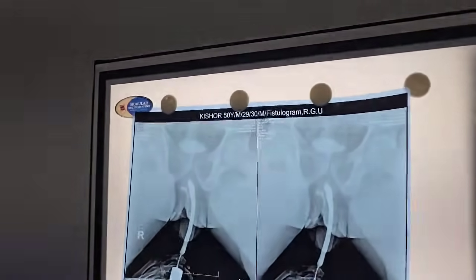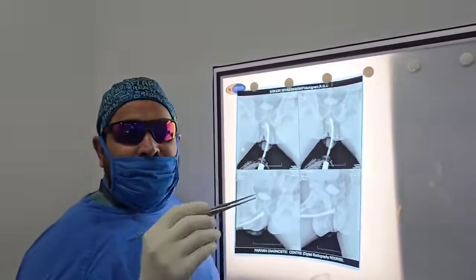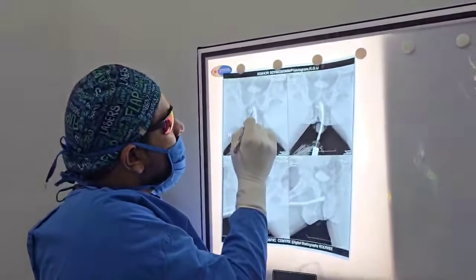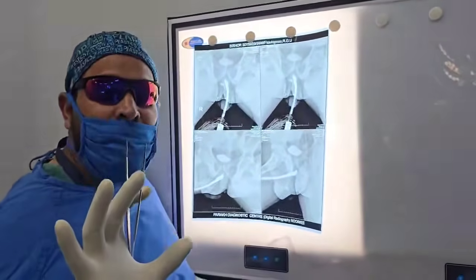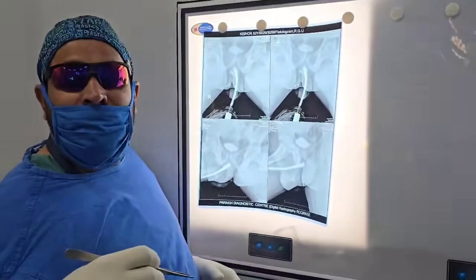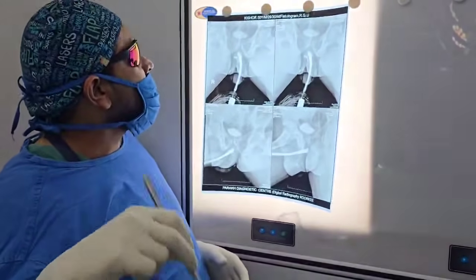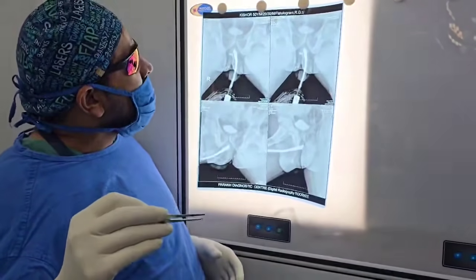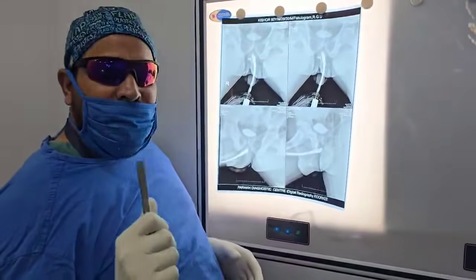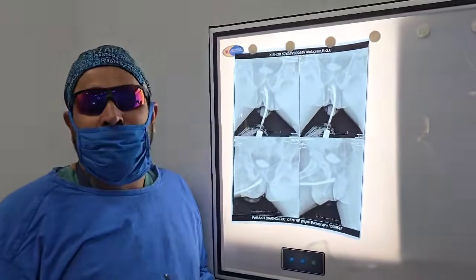What happens when we give laser ablation? When we give the laser energy nearby this area, sometimes there may be friability of the tissues, which are very much nearer to the urethra, and it may sometimes injure it. And there is a leakage of urine inwards, near the urethra, and it sometimes enters into the scrotum. So the approach is very important and tricky.